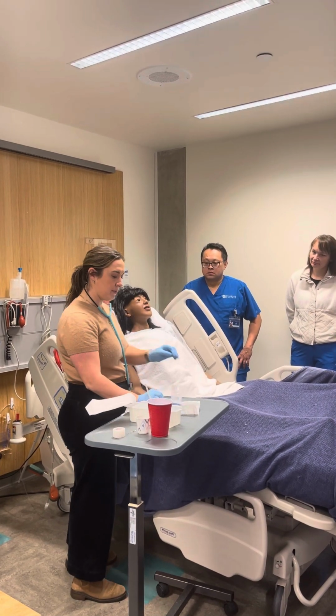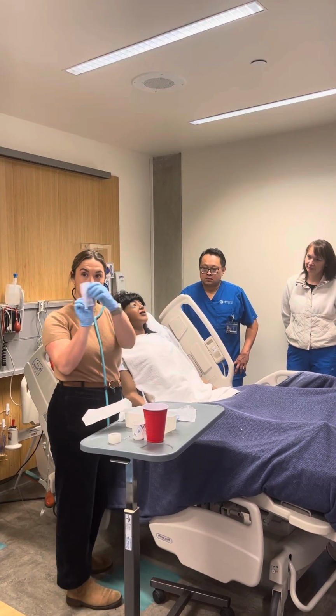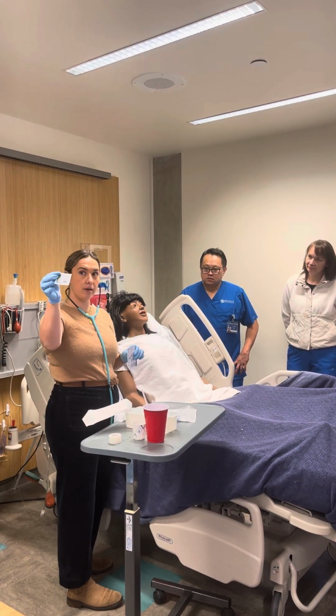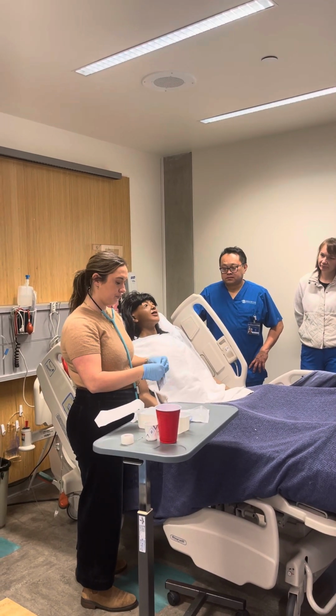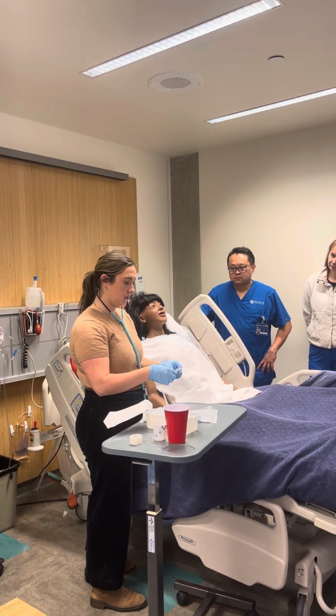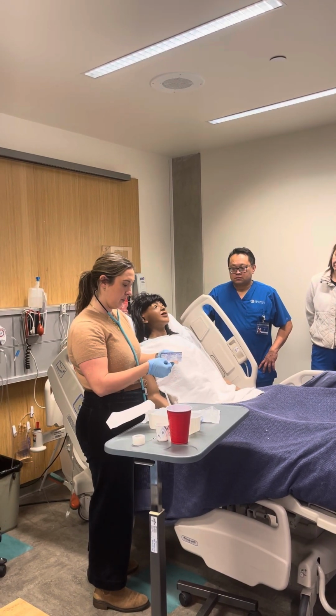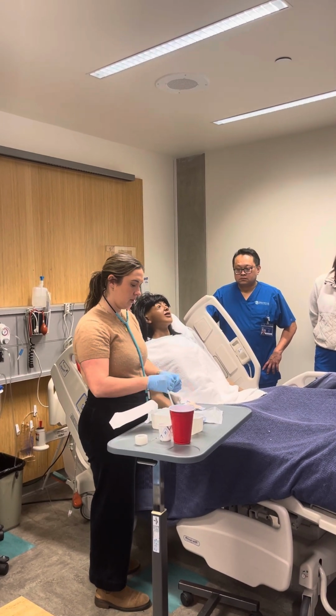So I'm going to do my measurement. I'm going to open this. This is my securement device, and then it comes with skin prep. So I'm going to open this. It doesn't really matter how you open it because it's clean. You're supposed to be able to peel it apart here, but I always find that difficult. And a little tear here.